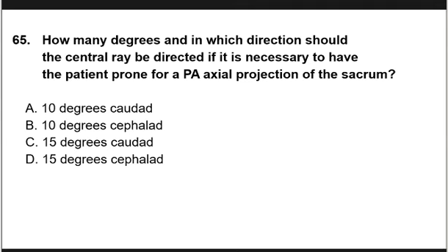So what are the projections that we normally perform to demonstrate this sacrum? We have only AP axial and lateral. Those, AP axial and lateral, are what we perform. Those are the routine projections for the demonstration of the sacrum.